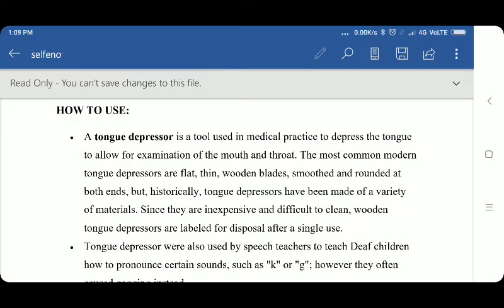First, we will see how the tongue depressor is used. A tongue depressor is a tool used in medical practice to depress the tongue to allow examination of the mouth and oral cavity as well as throat. The most common modern tongue depressors are flat, thin, wooden blades that are smooth and rounded at both ends.